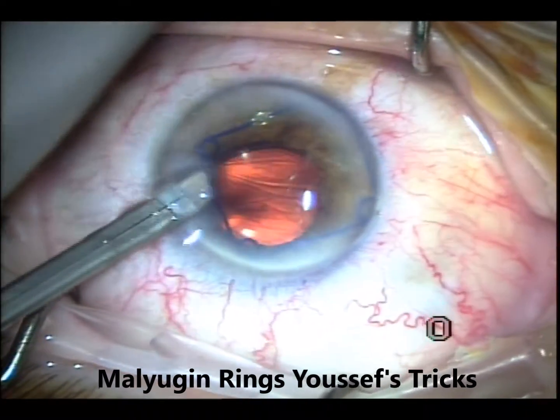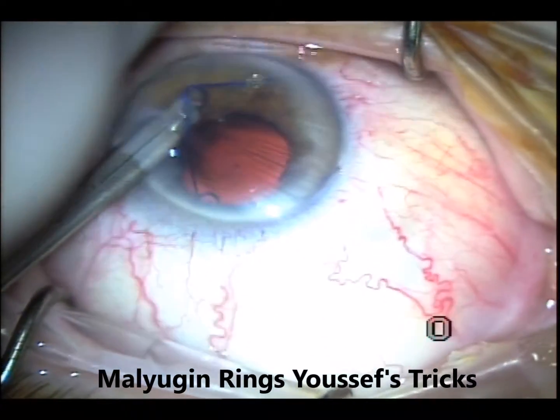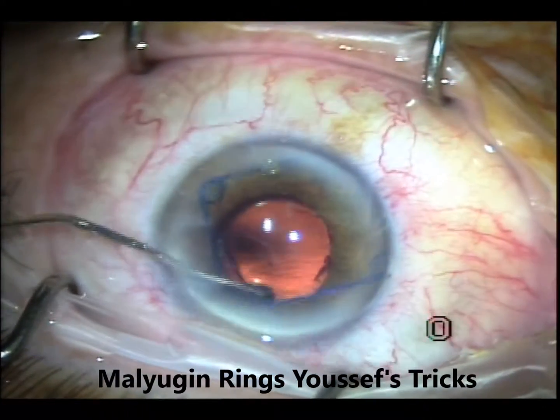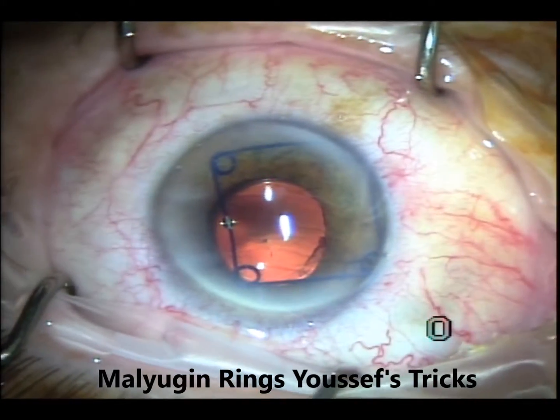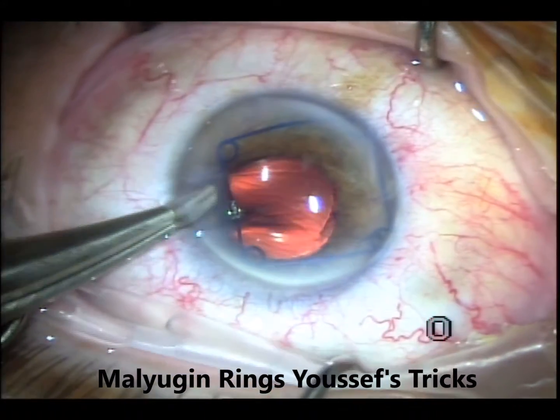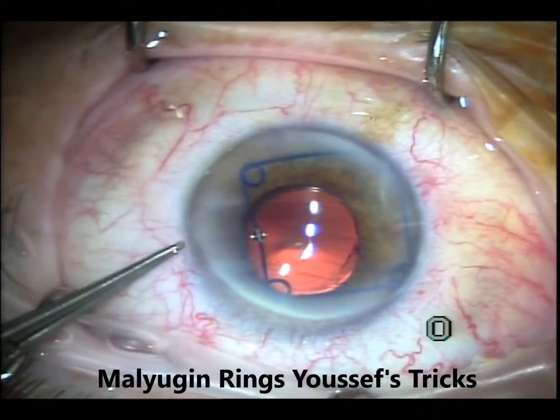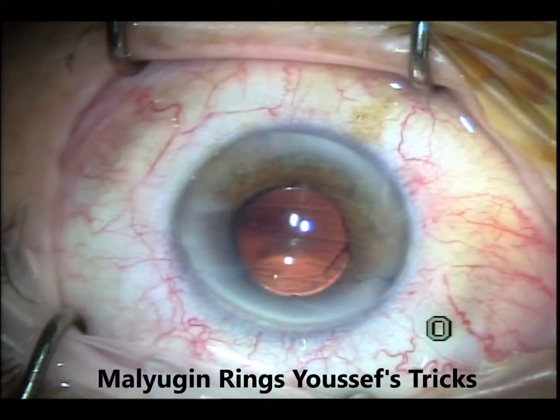I saw a trick at one of the conferences — I can't remember who presented — that it's easy to cut the ring and move it. I'll position the Malyugin ring so that I can actually cut it with Westcott scissors. You put one of the bars close to the incision — it doesn't matter which bar — go in with the Westcott scissors and cut that bar. Then with my forceps I'll pull the ring out and roll it out. It was very easy.